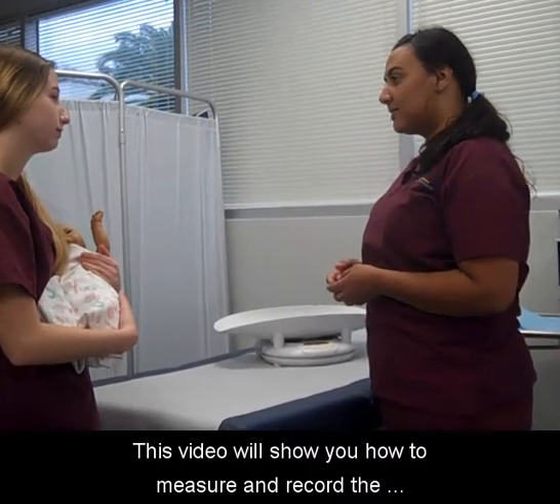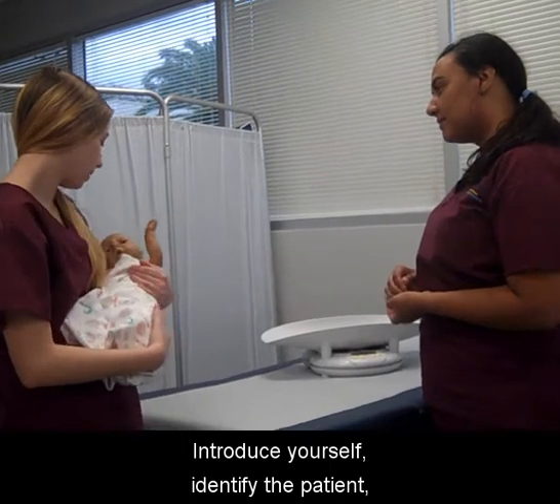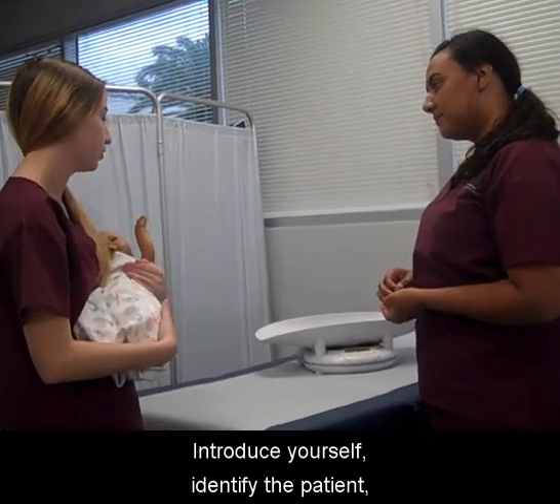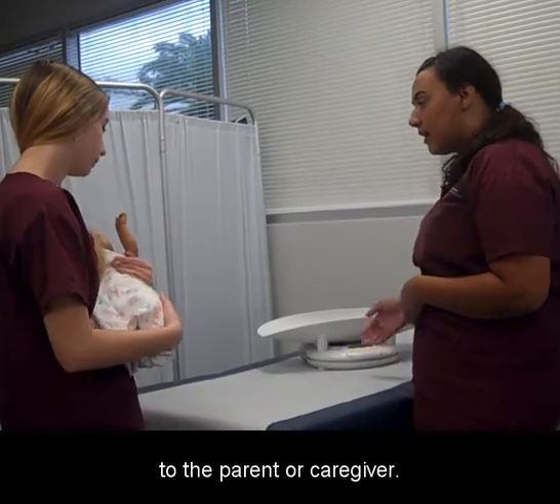This video will show you how to measure and record the weight of an infant. Introduce yourself, identify the patient, and explain the rationale for performance of the procedure to the parent or caregiver.